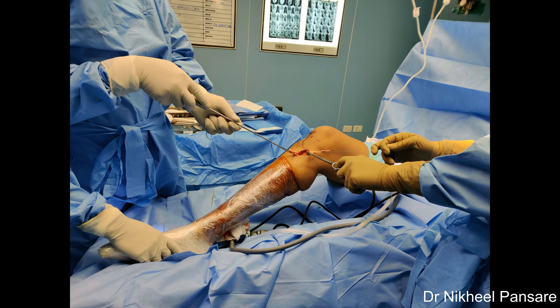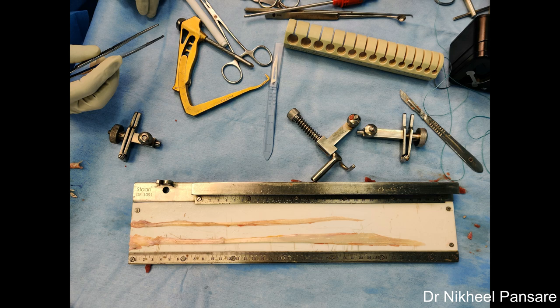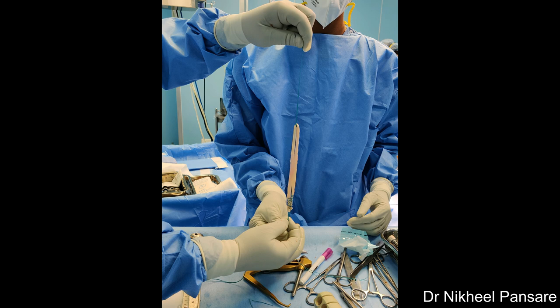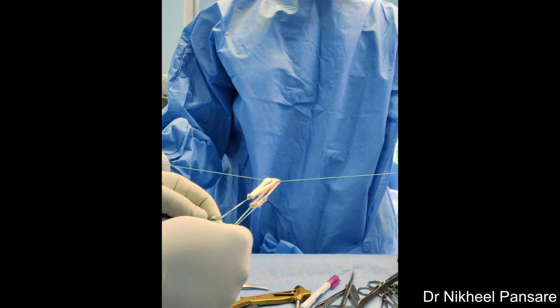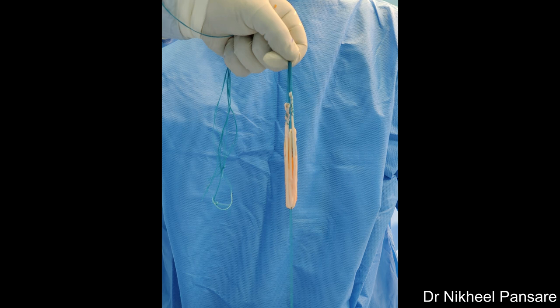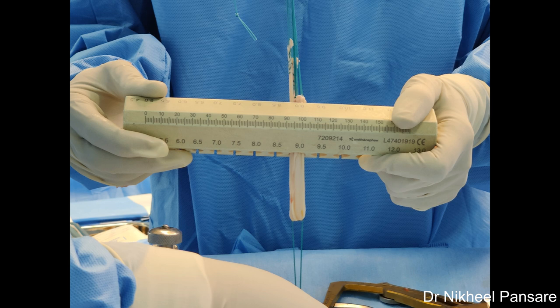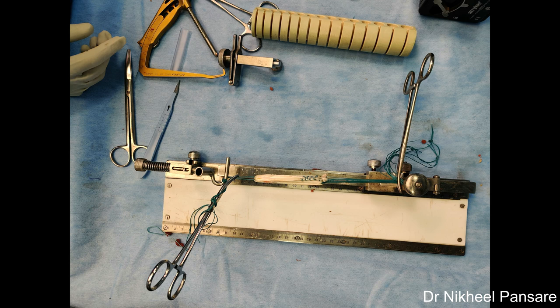Tendons are placed on graft board and debulking is done using a blunt scraper to take out all muscle fibers. Here the length of semitendinosus was about 32 cm, so we decided to quadruple the semitendinosus. If the length is shorter, you can also make it triple folded. Gracilis is doubled over the quadrupled semitendinosus. The final thickness achieved was 9 mm at both ends. Minimum 7 mm of graft thickness is considered acceptable. Anything less than 7 mm should be augmented with number 2 fiber tape as internal bracing — which is a newer technique used widely nowadays for faster rehabilitation during initial days of graft healing. The graft is put on tension for 20 minutes on the graft board. We prefer to cover the graft with wet gauze piece and sprinkle some injection gentamicin over the gauze piece.